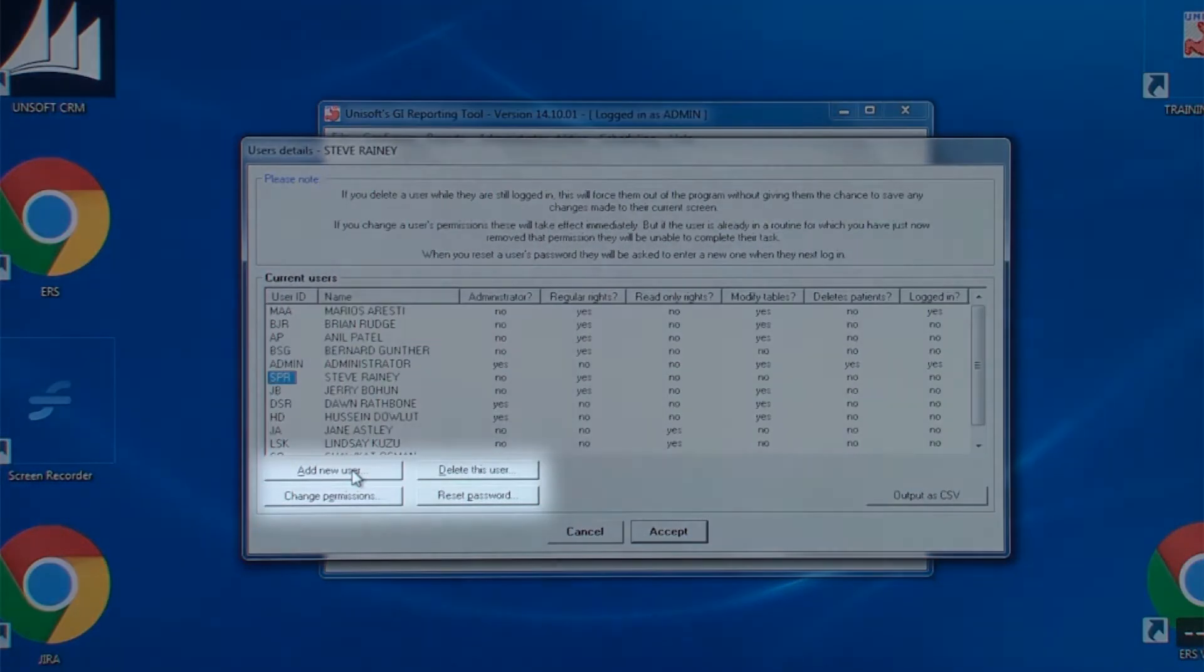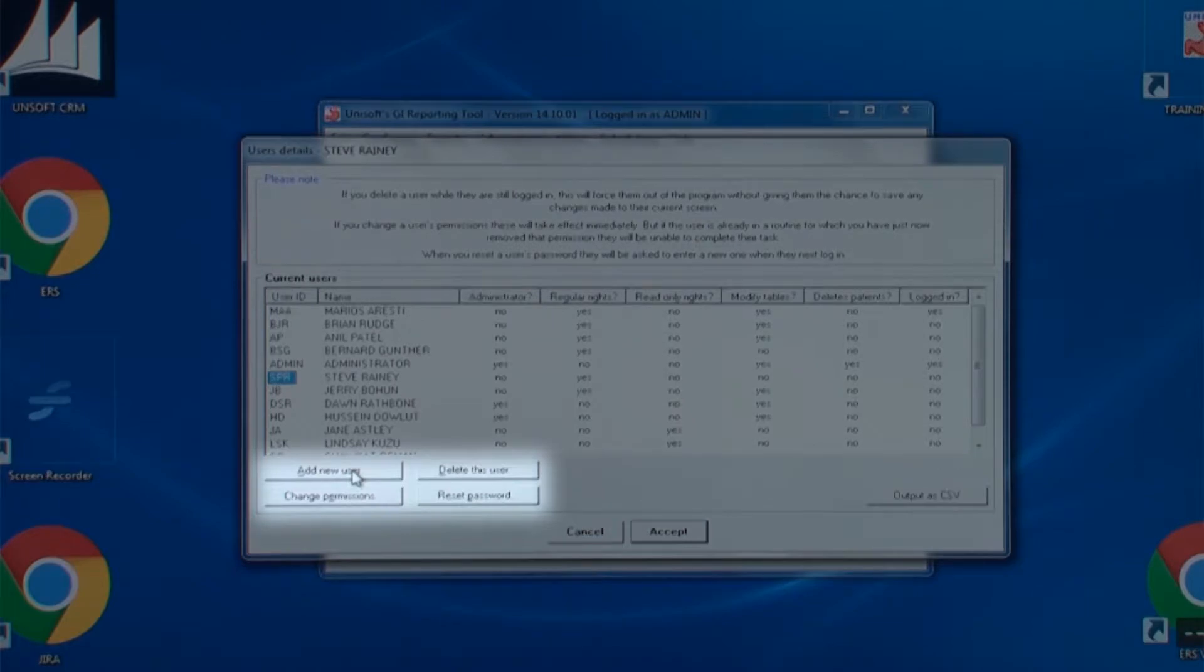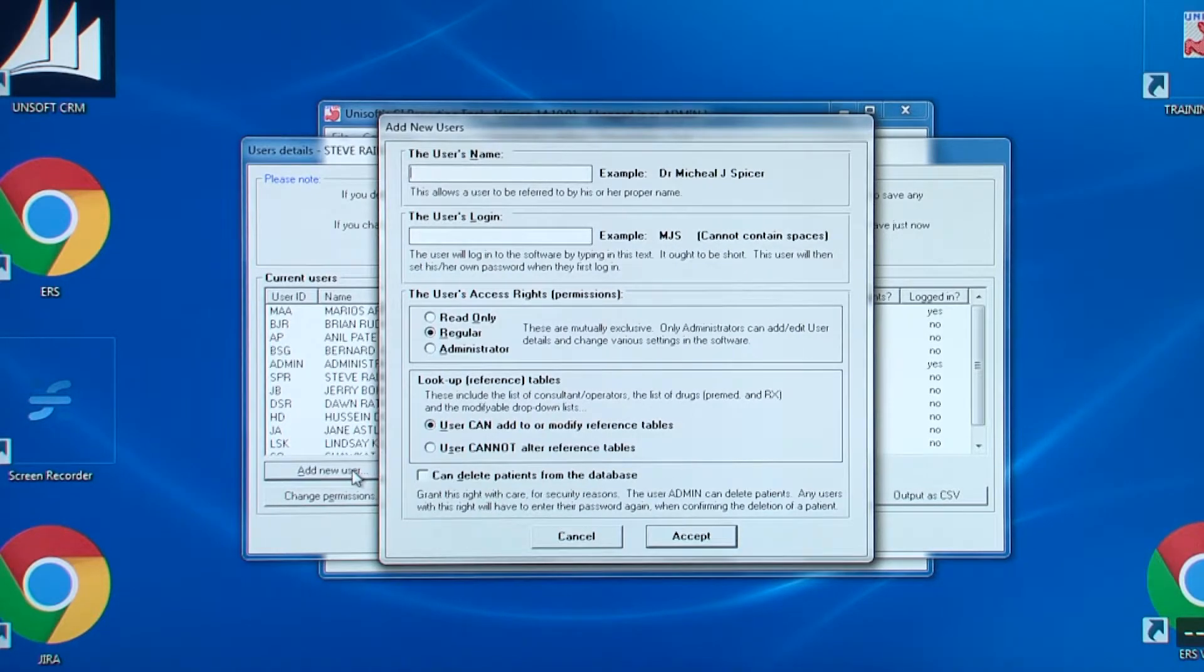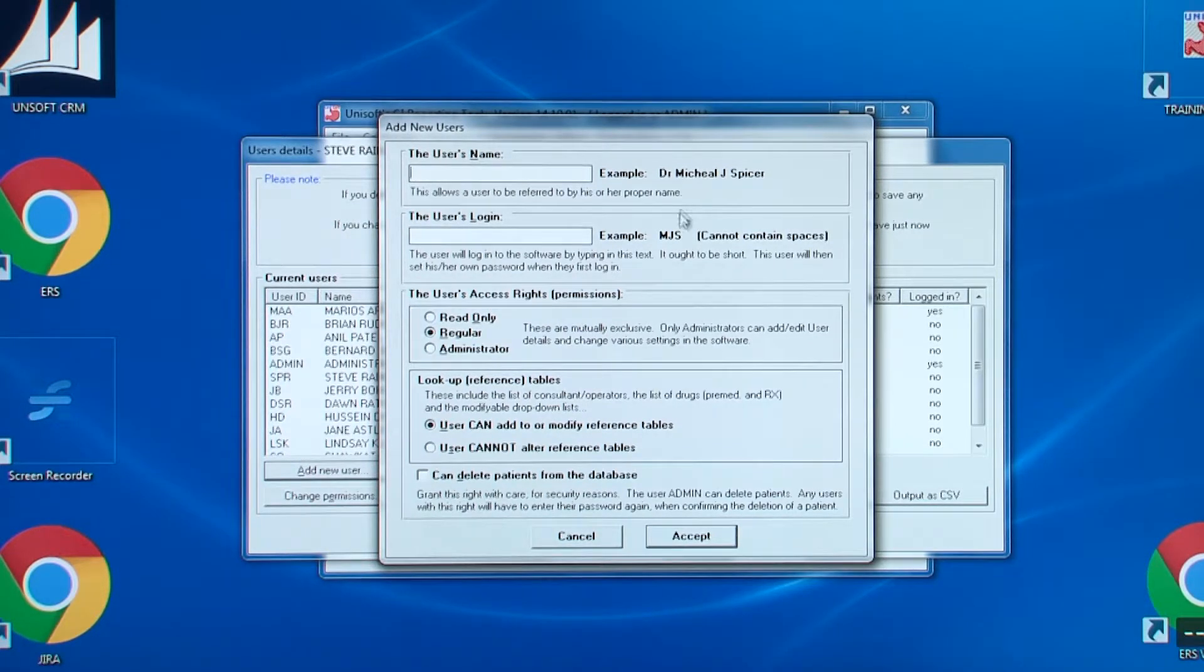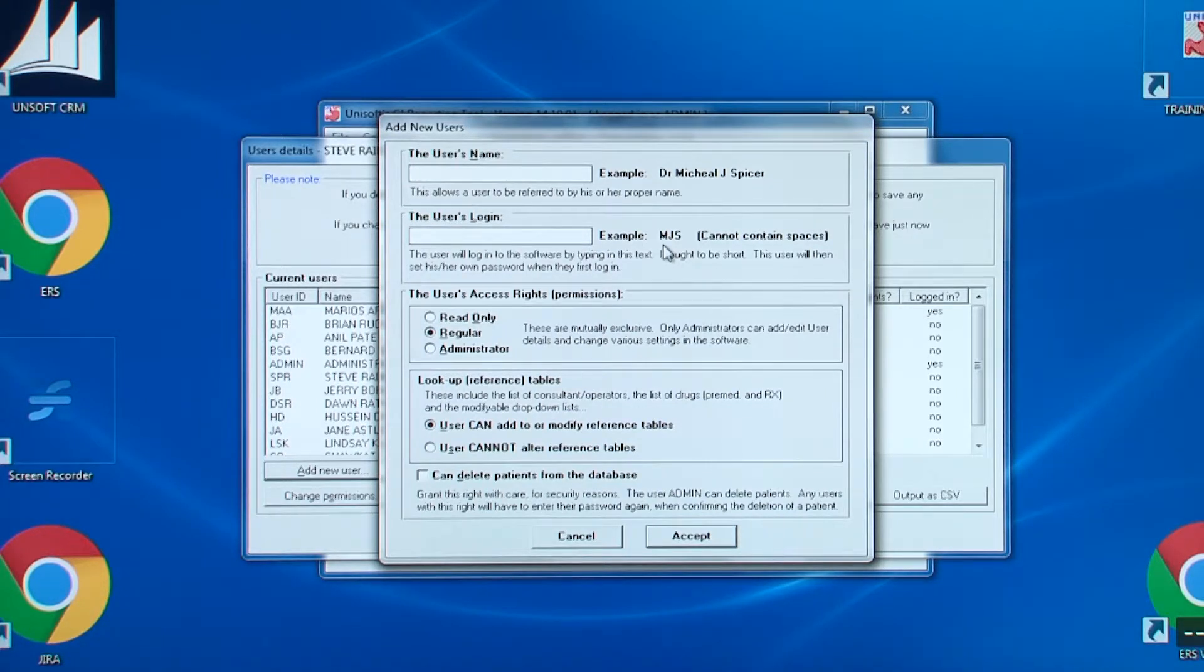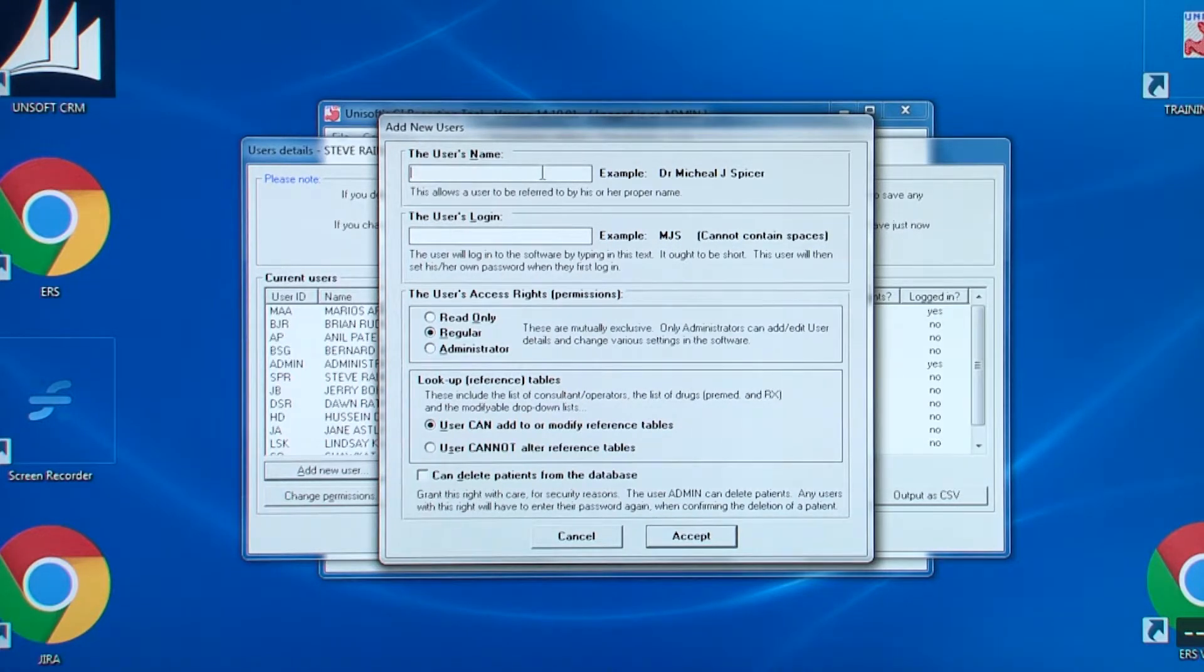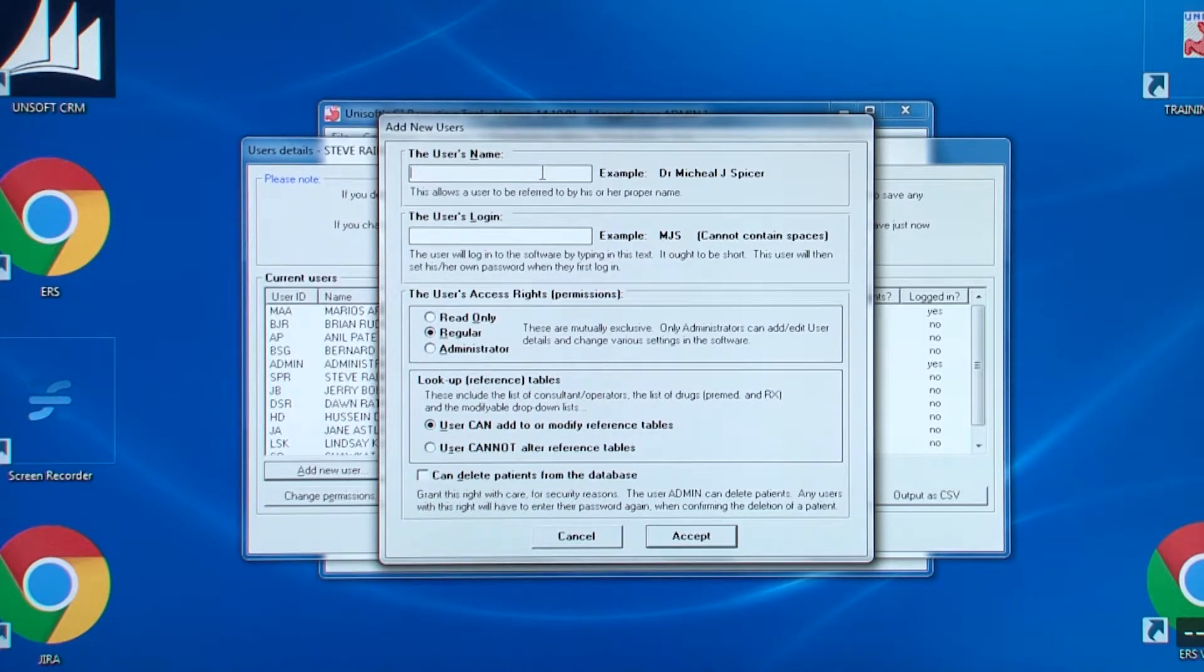The first button of four is add new user. When you click on a login, the remaining three buttons become enabled. Firstly, we will look at adding a new user. Note that there are sufficient examples to explain what needs to be entered. And also note there is nothing about their password in this box. Only when this user logs in for the first time will they create their own password.